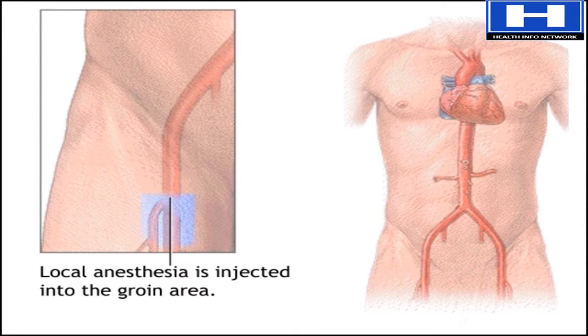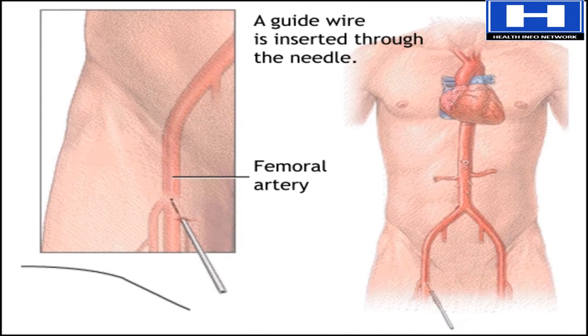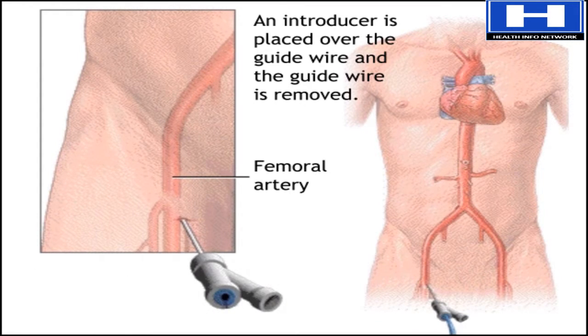First, a local anesthesia numbs the groin area. Then the doctor puts a needle into the femoral artery, the artery that runs down the leg. The doctor inserts a guide wire through the needle, and then removes the needle. He replaces it with an introducer, a tubular instrument with two ports used to insert flexible devices, such as a catheter, into a blood vessel.